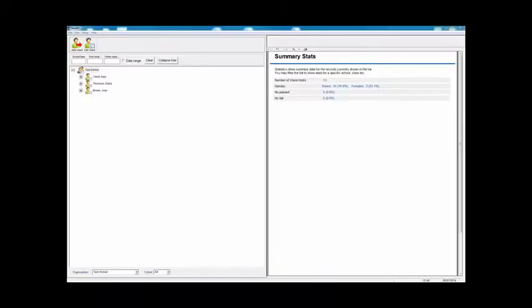In this brief demonstration, I'm going to be showing you the main features of the ReadEasy screening software. This is a really powerful system designed to help you diagnose and manage Meares-Irlen syndrome, or visual stress.